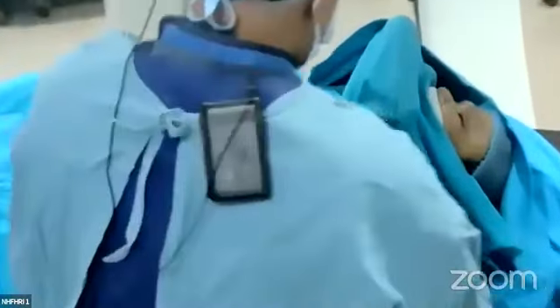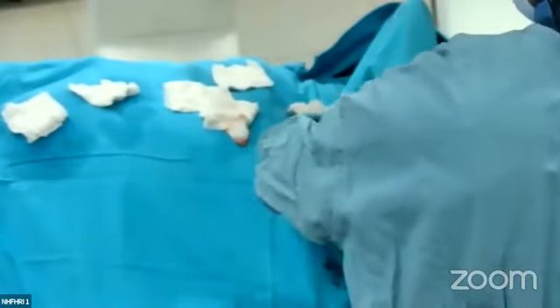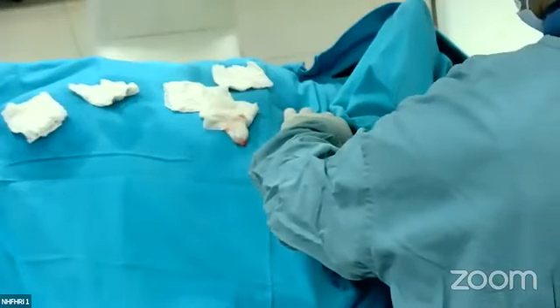So usually what we used to do initially is local anesthesia, about 2 centimeters below the left clavicle.